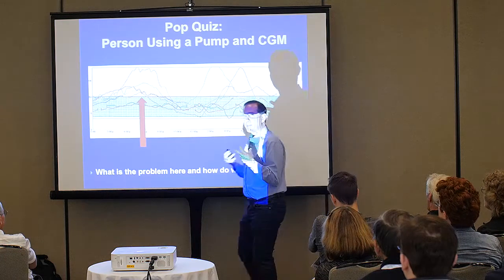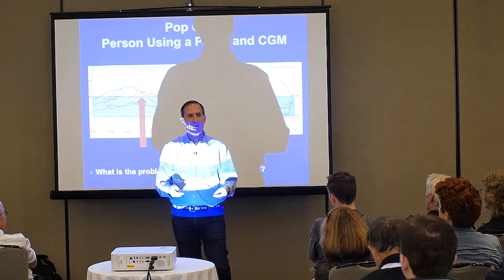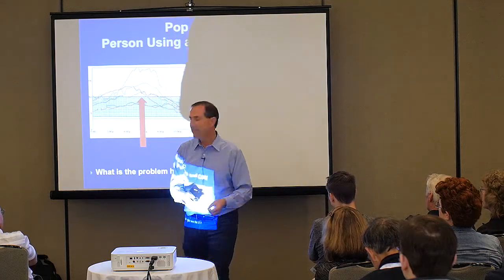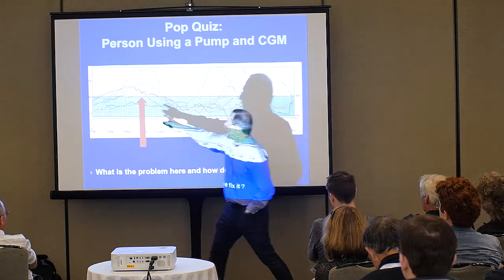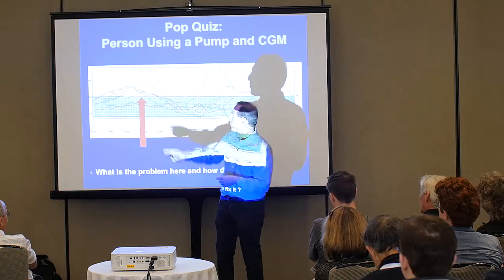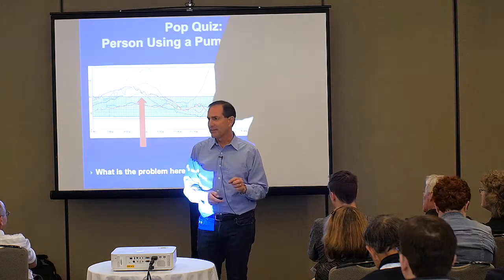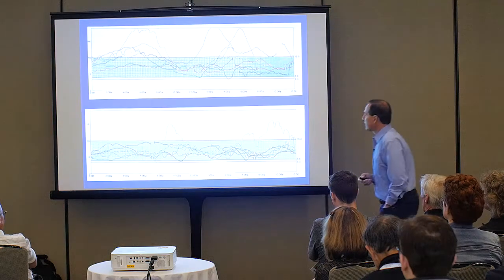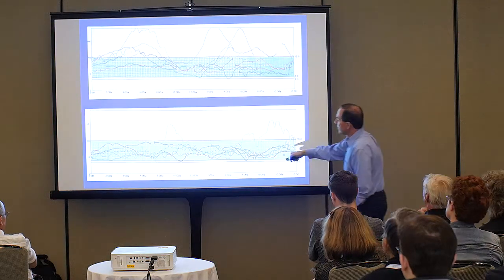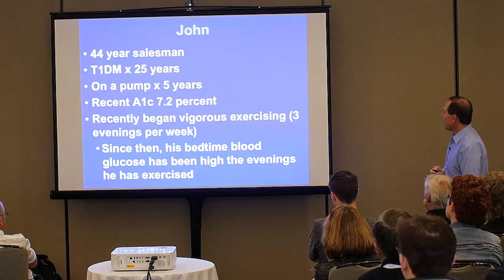And if you have a pump on, the way you stop that from happening is what? You increase your basal overnight. So when you're reviewing your CGM data, if you find you're trending up overnight without eating, and this person wasn't eating, then you probably need more basal overnight. And remember, start 3 hours before the problematic time. So we adjusted her settings, and isn't this awesome? It made me feel really good.